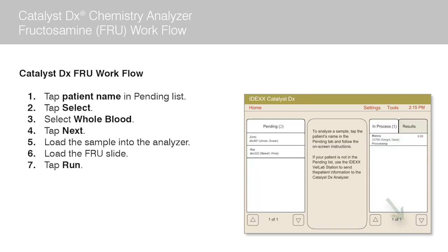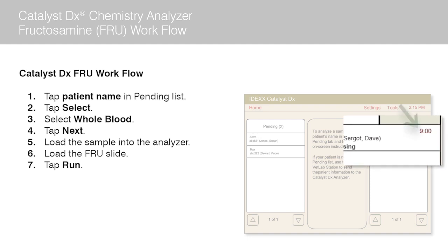Tap run. The Catalyst DX Analyzer begins to process the patient sample automatically. A timer displays next to the patient's name in the in-process list, indicating the time remaining until the run is complete.